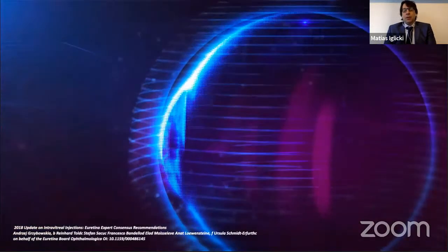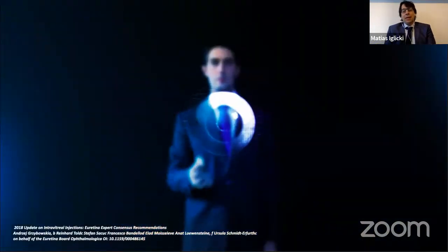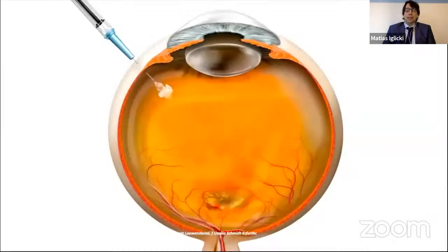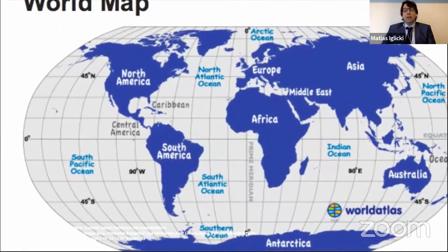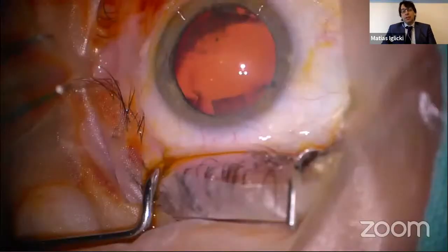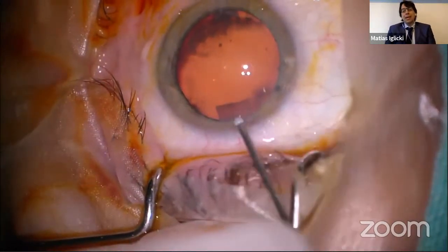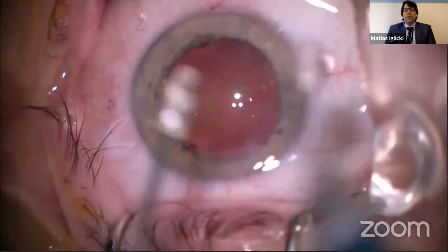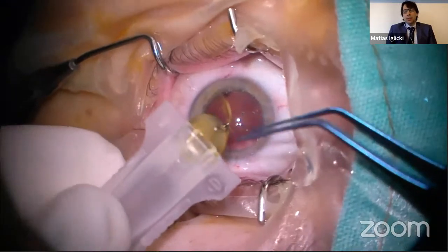So nowadays we have several resources that we can extract from inside the eye and select the best, in this case, needle, in order to perform the Yamane technique. As you might know, this technique is the most common in the world when you face these kinds of patients. But let me start the presentation by showing this. Everyone in this group, attendees, presenters, panelists, wants to perform the surgery and insert a multifocal intraocular lens like this one.